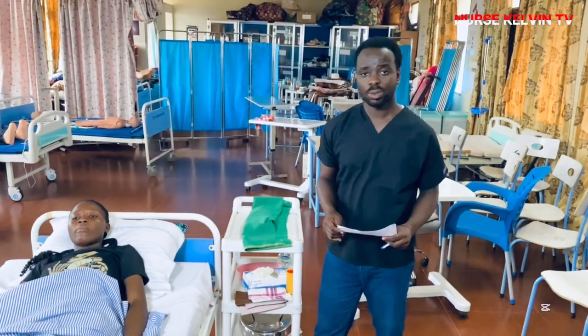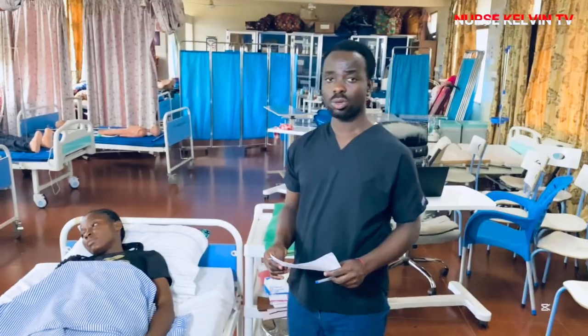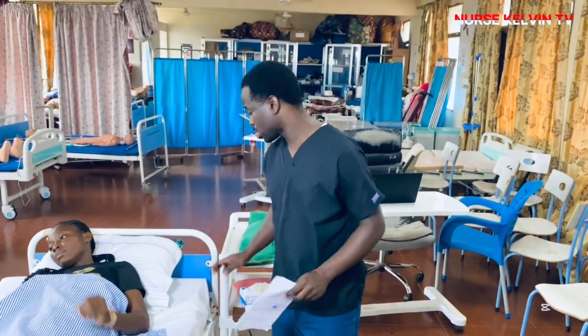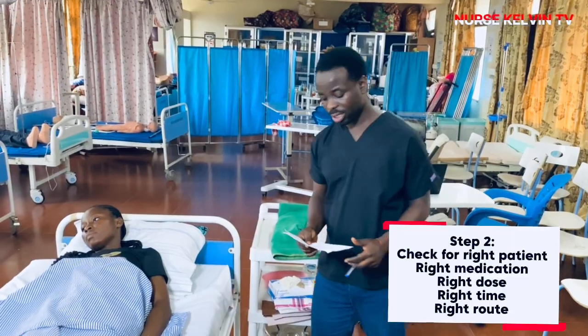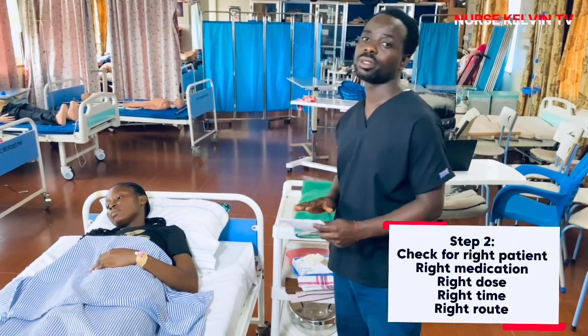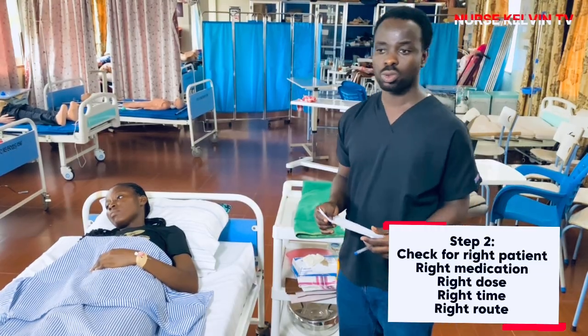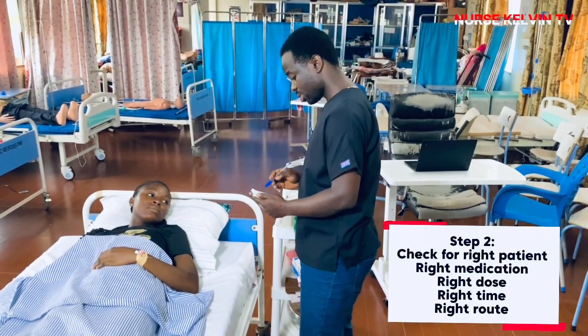So guys, I'm done with explaining the procedure to my patient and also establishing rapport. And then with the medication chart, I have to check for the right patient, right medication, right time, and then the right dose.